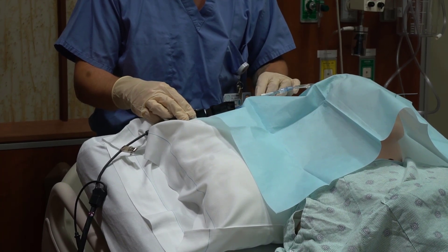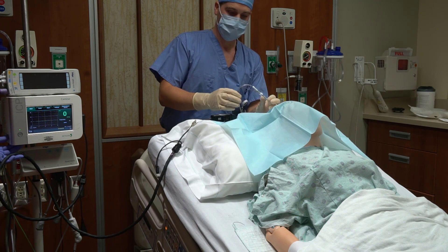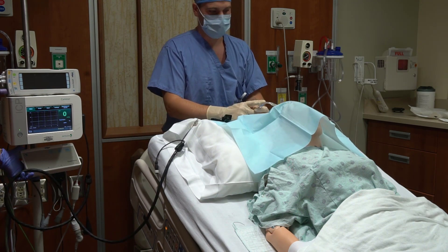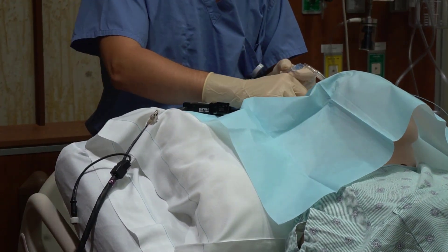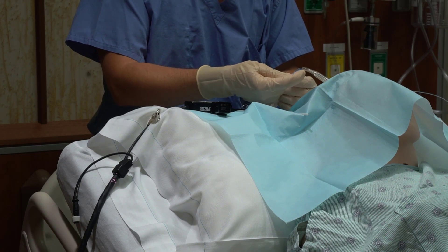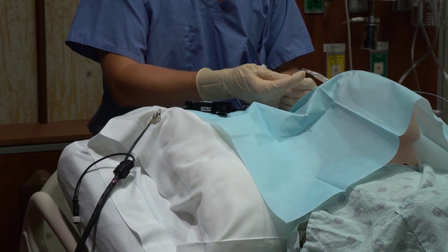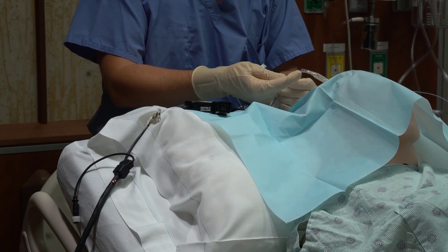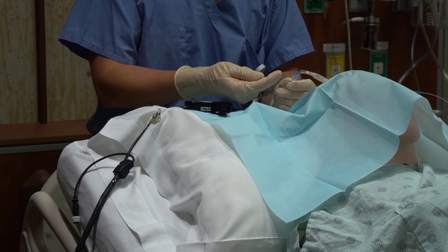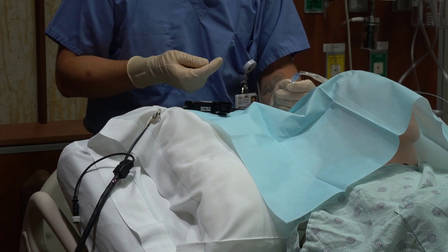After insertion, it should immediately show an ICP waveform and pressure. Importantly, on the intraparenchymal monitors, there is a red dot that lies between the very tip of the catheter and an etched marking. That red dot should almost always remain between those markings. If it gets dislodged, pulled back, or pushed forward, it can give abnormal ICP readings. So if the ICP doesn't correlate with the patient's exam or reads abnormally high or negative, first check whether that red dot is within those markings.